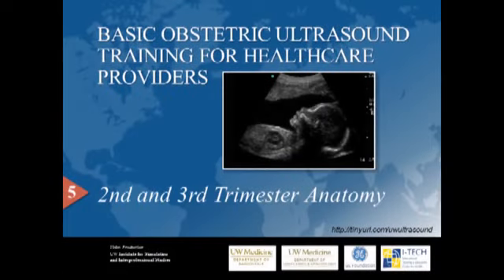My name is Dr. Christina Adams-Waldorf, and I will be narrating this 5th video in our pregnancy ultrasound series. This video will introduce how to recognize fetal anatomy in the 2nd and 3rd trimesters of pregnancy. Please visit our website for access to all of our video and training materials.